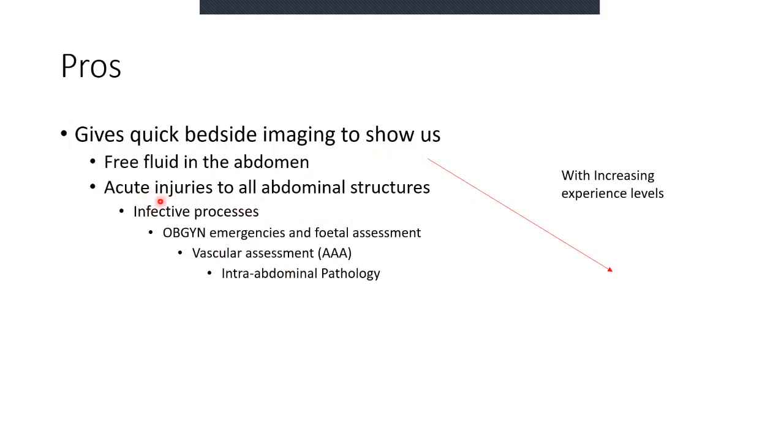Signs of renal compromise, things like that. OBGYN and fetal assessment, this comes a little bit later. It's not at the forefront of the EFAST, but it comes to the forefront of the EFAST when you are dealing with a pregnant patient, of course. There are a few gynae emergencies that are quite important for us to know and that we should be able to pick up, and we will get to those. Obstetric as well in terms of trauma, as well as fetal assessment. There's a lot that we need to know there, but that will be a whole section of lectures.